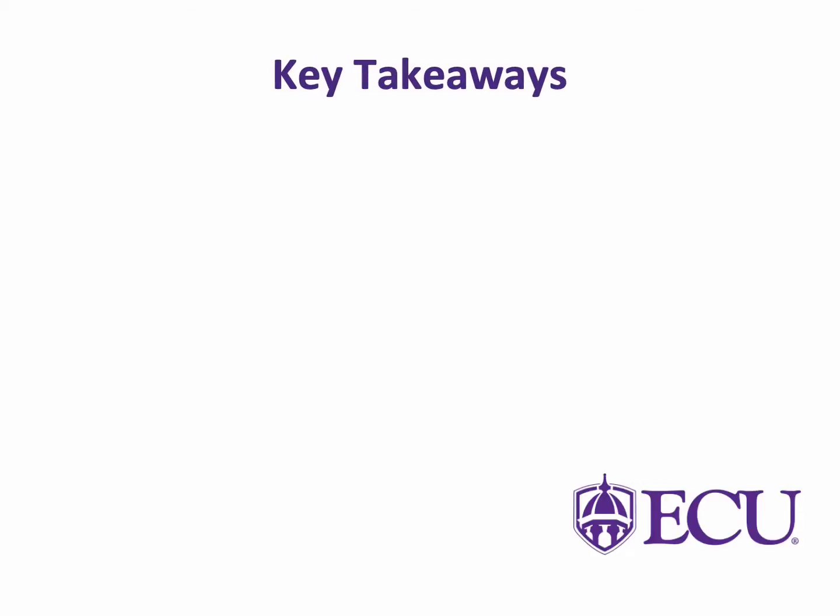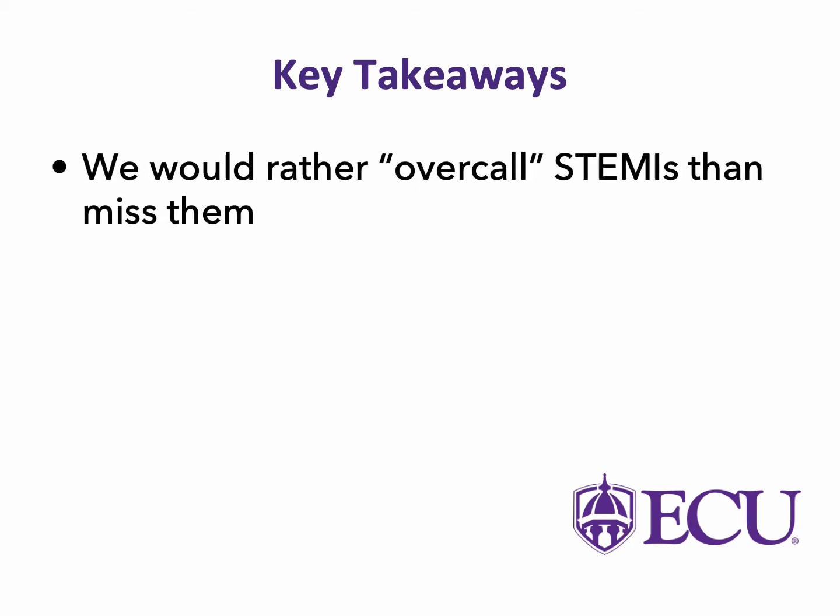So some key takeaways for this presentation that we're going to talk about today. In general, we'd rather overcall STEMIs than miss them. Obviously, there's high mortality associated with having a heart attack, and we don't want to miss them. But context matters, right? We'll get into this a little bit later on, but knowing who the patient is, what they're presenting with, what their chief complaint is, what they look like, is going to be very, very important for this.